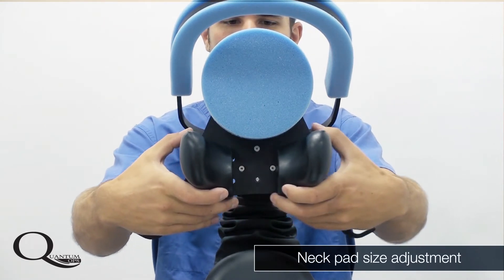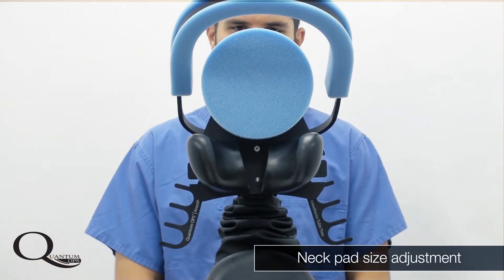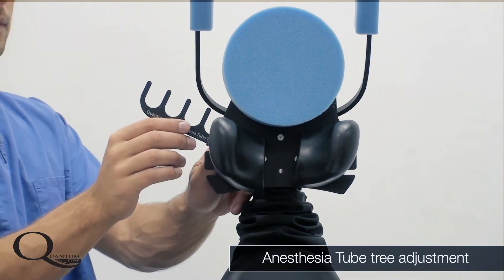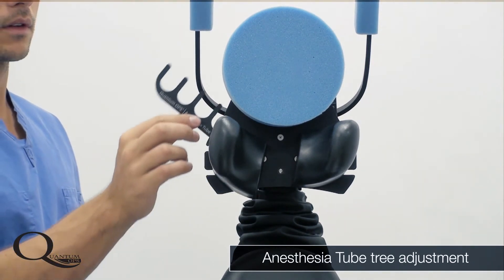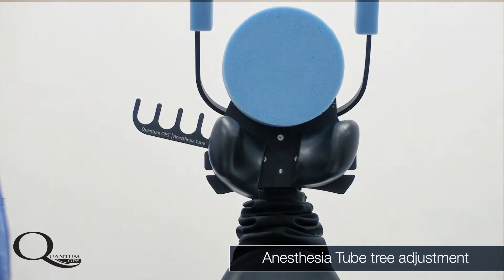The wide range of settings allows the positioner to accommodate all different sizes of patients. The tube tree mounts to the knob which controls the neck pad and is easily rotated up and out of the way, or down into the usable position, by loosening the knob.